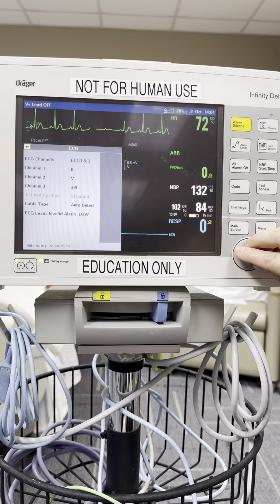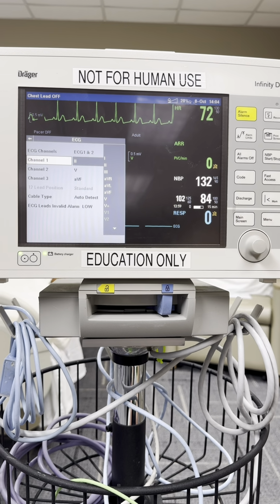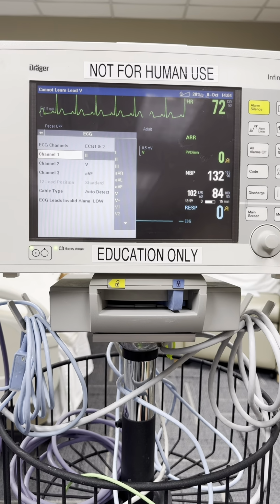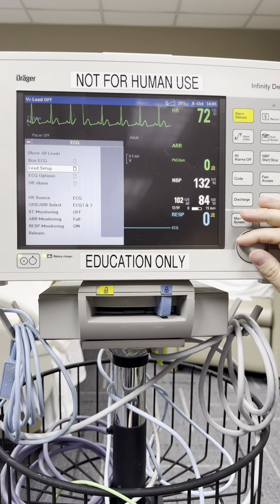Lead setup. You can change what lead you're viewing. If you're having trouble with lead 2, you can switch that to lead 3, or whichever lead is giving you the best reading. You can switch those around.